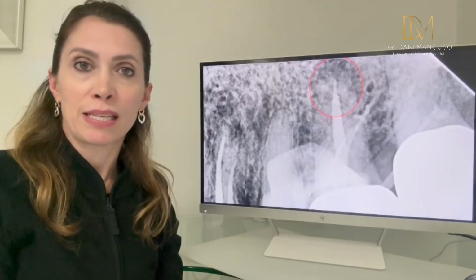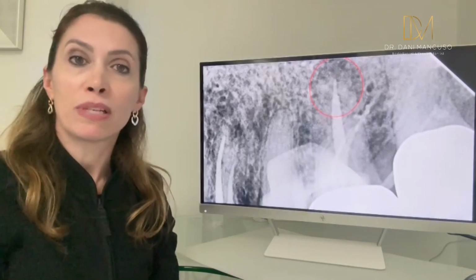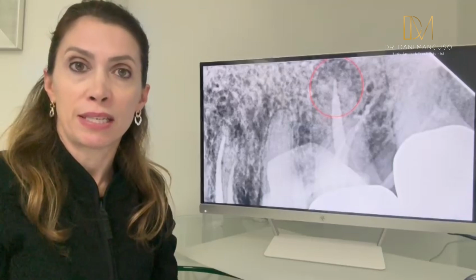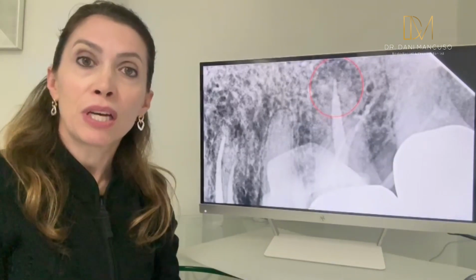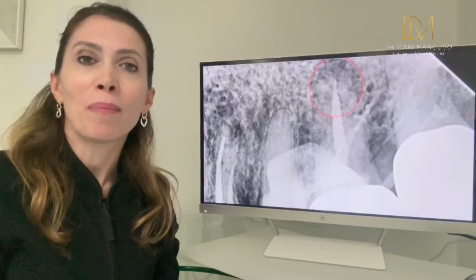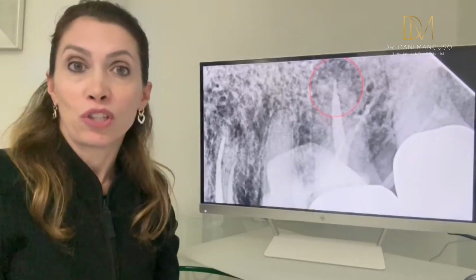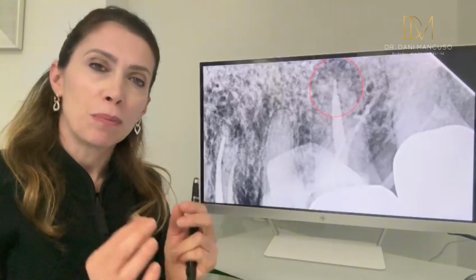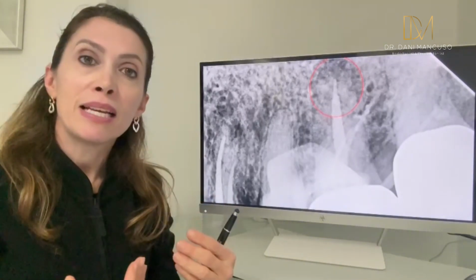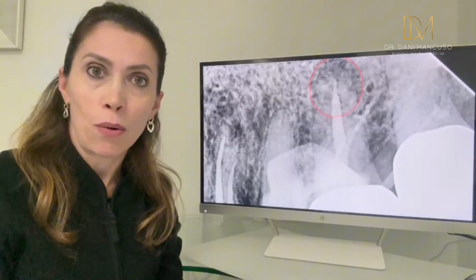When you use a rotary system, imagine the gauge of the rotary system is 30. You can use a GP size 30, but will that fit? It depends on the shape of the canal. It may be that canal is oval, which most of the canals are, and then the GP will fit to some extent, but will create lots of voids. The sealer needs to go together with the GP.